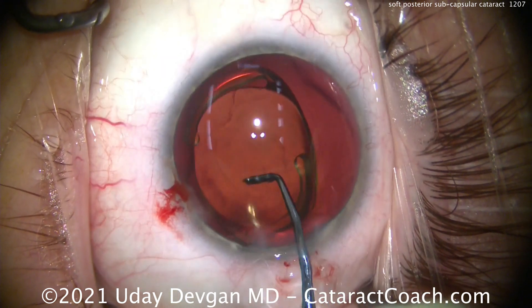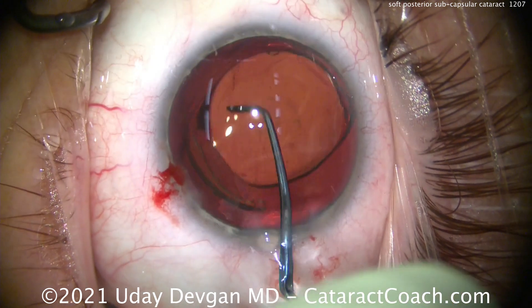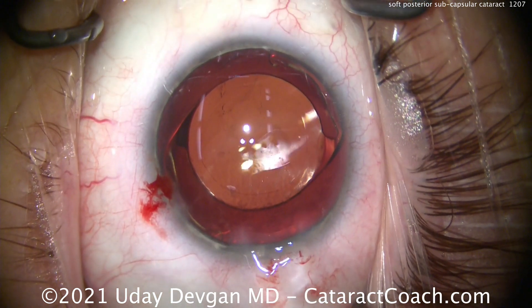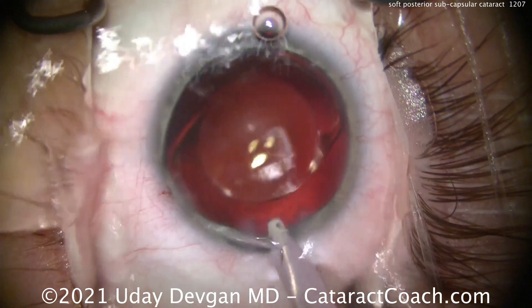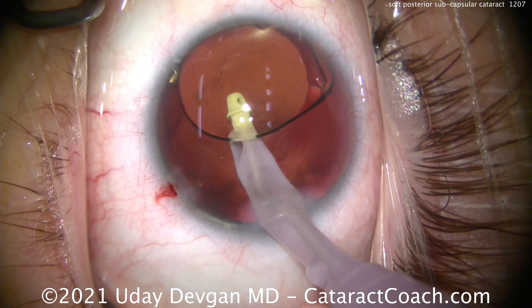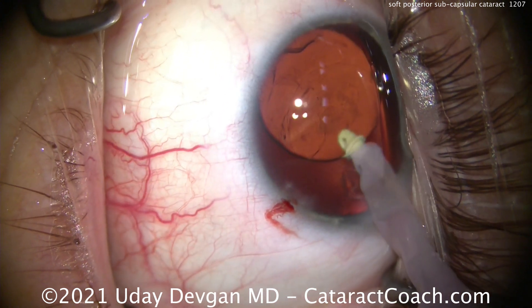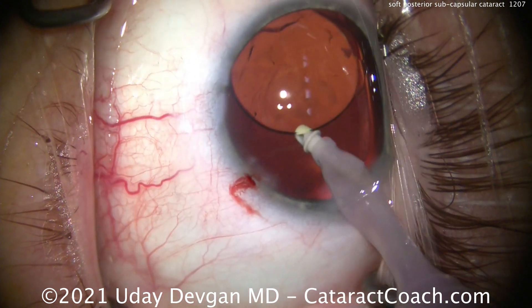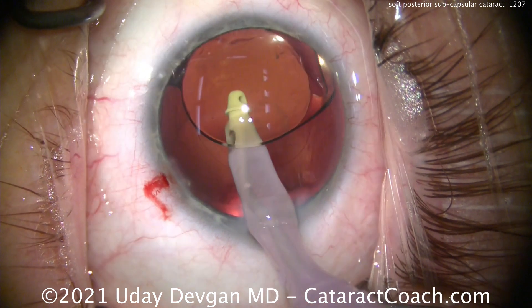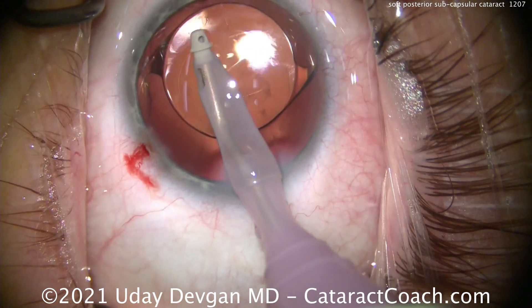The lens goes into the bag quite nicely. I am rotating the lens to loosen the sub-incisional cortex — looking carefully under the incision there is a tiny bit of cortex left. Moving the lens around made a big difference in loosening that up. Going back inside to remove the viscoelastic from behind the optic and retrieving that sub-incisional material, leaving the eye in a beautiful state.